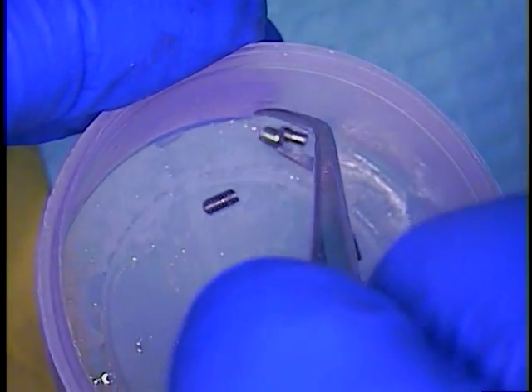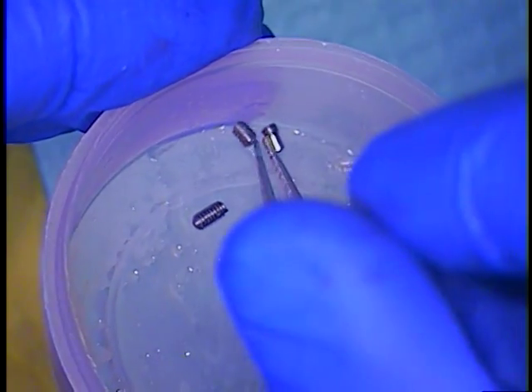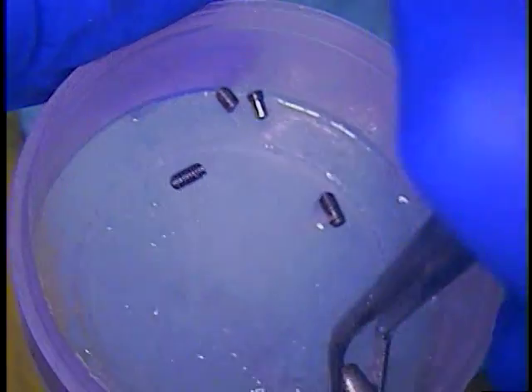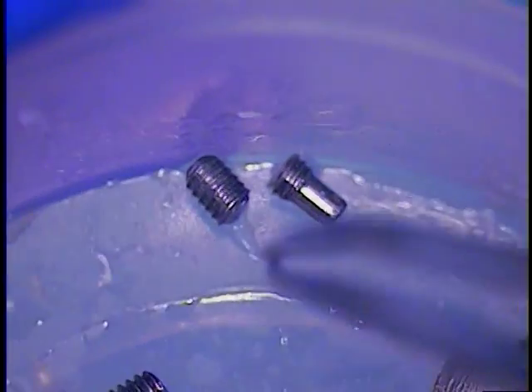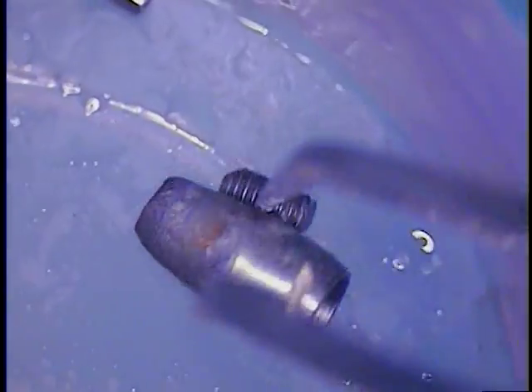She had a double fracture. In other words, the shaft fractured away from the abutment. So that is inside this, and here is the double fracture. So you have the screw that is still in the mouth, and then this was taken out first, and then another screw backed in there. That is how this all happened.